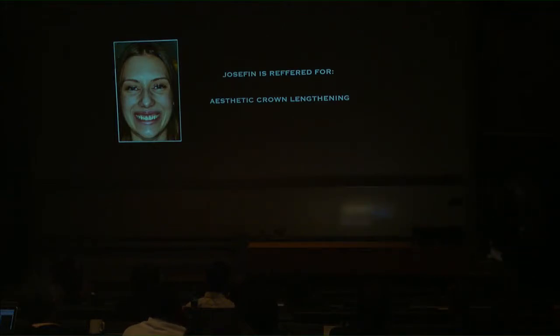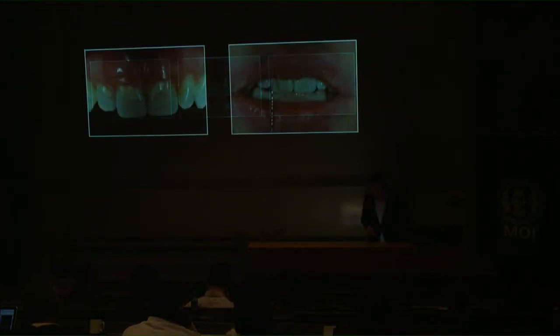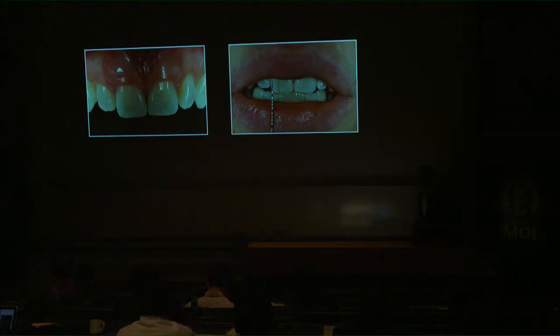She is referred for aesthetic crown lengthening, and these are her smile pictures. And she has beautiful, sexy teeth, but we just need to expose them further. And how can we do this in a predictable and safe way? As you see here on the picture to your right, at rest she shows approximately 4 millimeters of the incisal, and that leads us to think that it's of course impossible to lengthen the teeth to the incisal. We need to of course remove soft tissue in order to bring out her full smile.